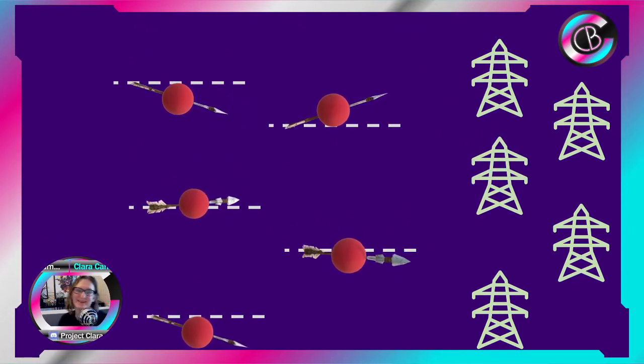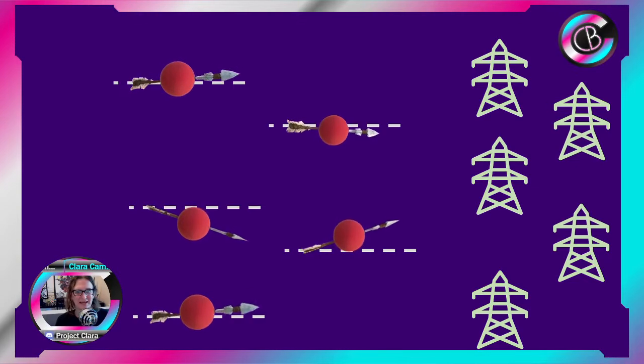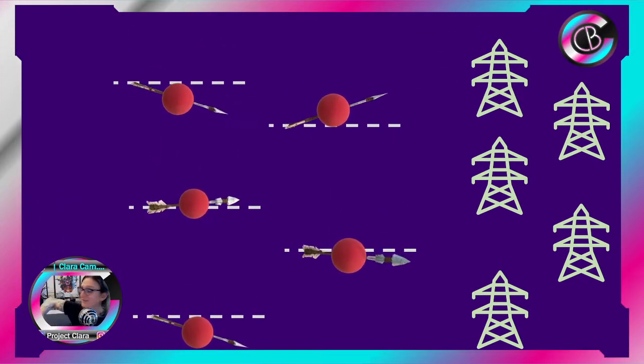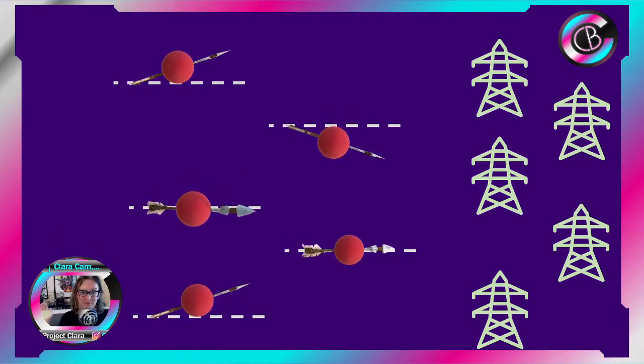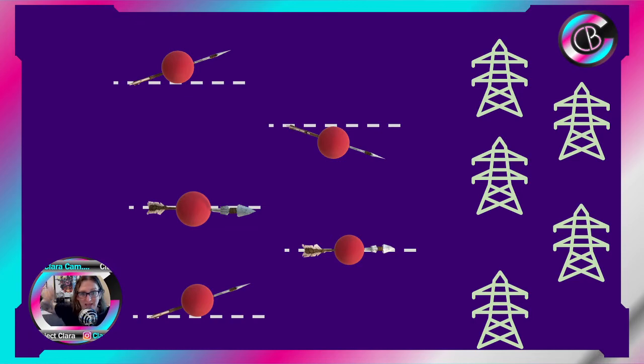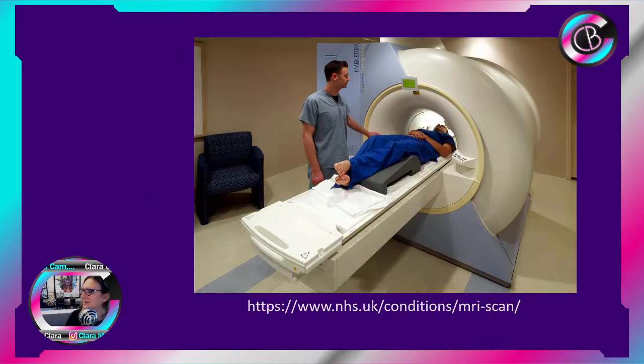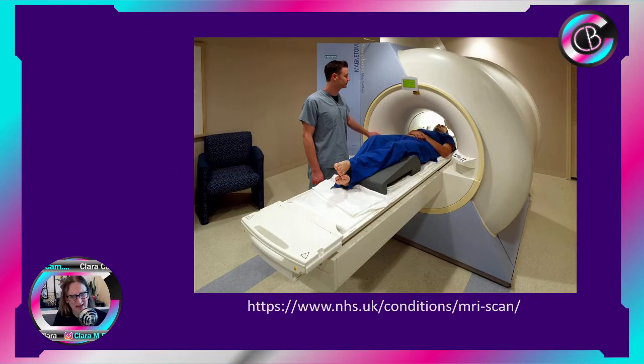I really do. And then, of course, you come out of the MRI, and the direction that the hydrogen atoms are spinning returns to the rest state, so they end up all random. They're no longer in one particular direction. So yeah, that's basically what happens with MRIs.